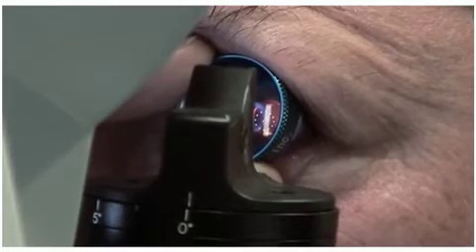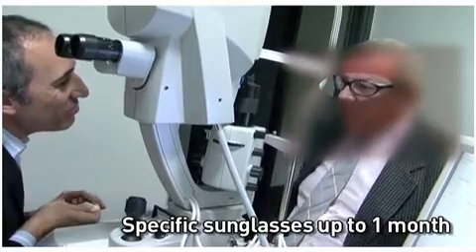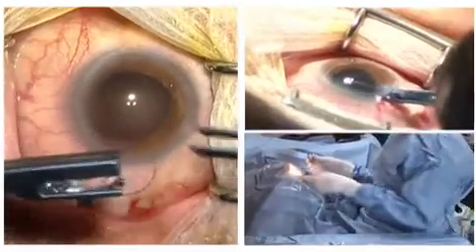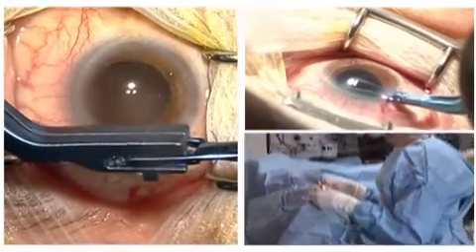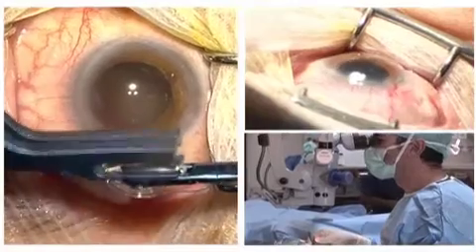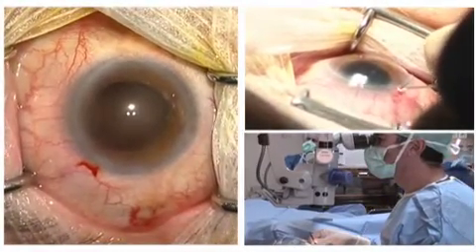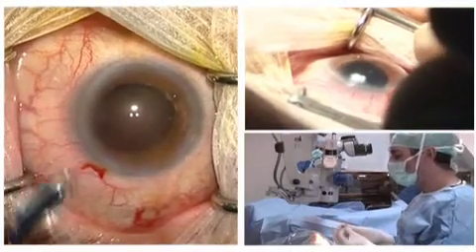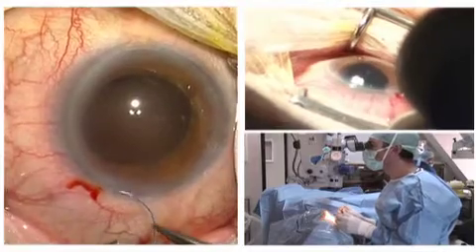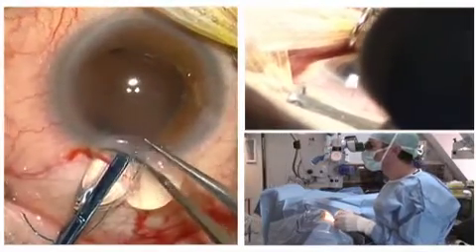Thanks to the adjustment of the lens, residual cylindrical error can be corrected with great accuracy. In most cases, this accuracy is better than a quarter of a diopter of sphere and/or cylinder for 90% of cases. These results are remarkable when compared to the outcome of toric intraocular lenses, for which only 40 to 50% of cases have a residual refractive error less than a quarter or half a diopter, depending on the series.